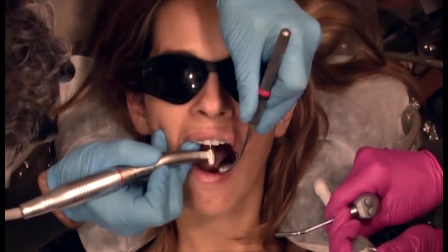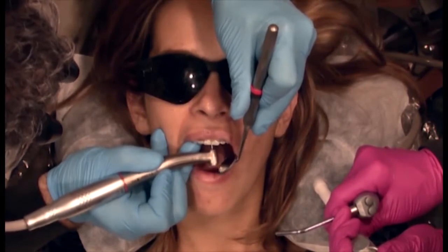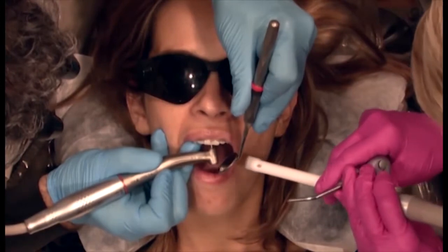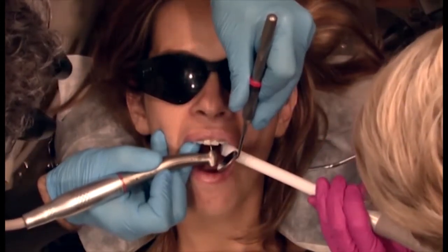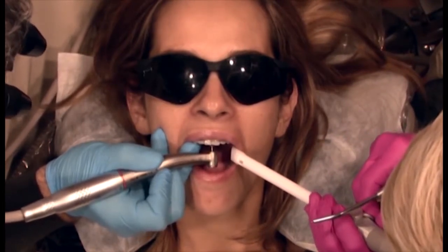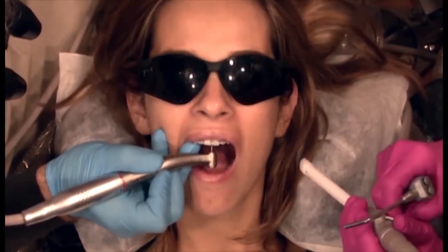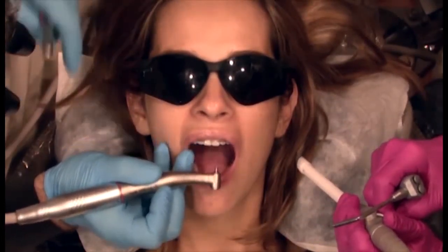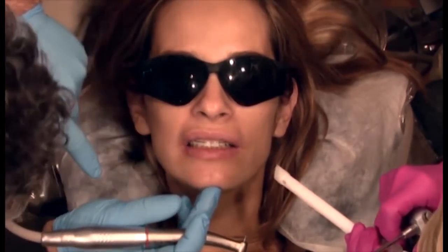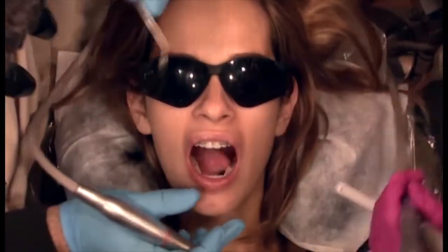Now, the tricky part is the spot for Katrine is getting very close to the back of the front teeth. So I'm making it shorter, and eventually a posterior tooth will come into contact as I continue to shorten the vertical height of the platform. Katrine, could you just tap up and down for me? Anything touching in the back? Nope. Let's mark the spot again and see where it is.